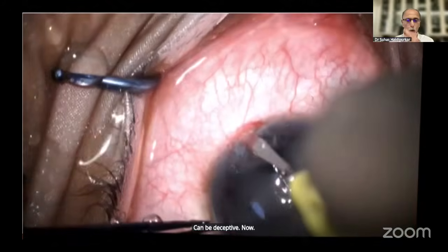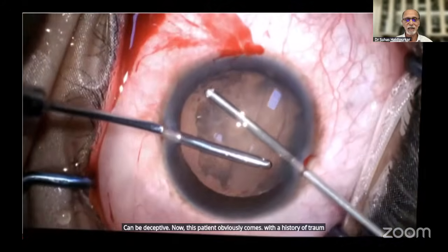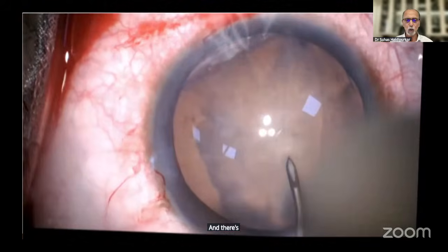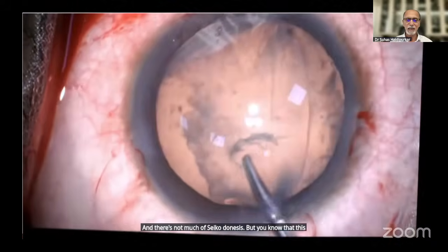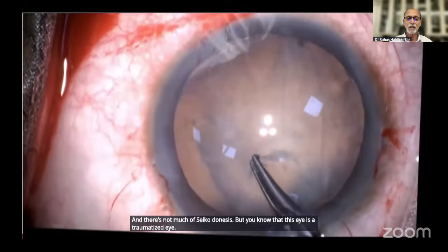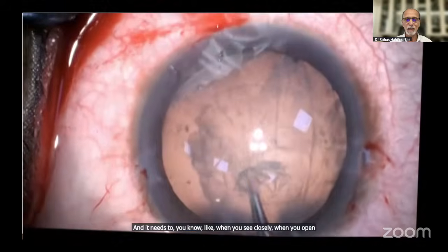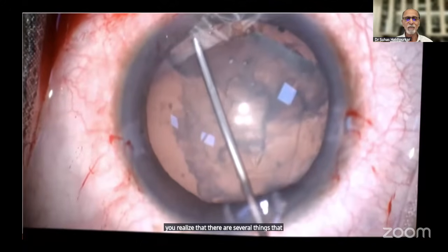Now, this patient obviously comes with a history of trauma on the previous day, and there's not much of phacodonesis, but you know that this eye is a traumatized eye, and when you see closely, when you open and go inside, you realize that there are several things that are not okay.